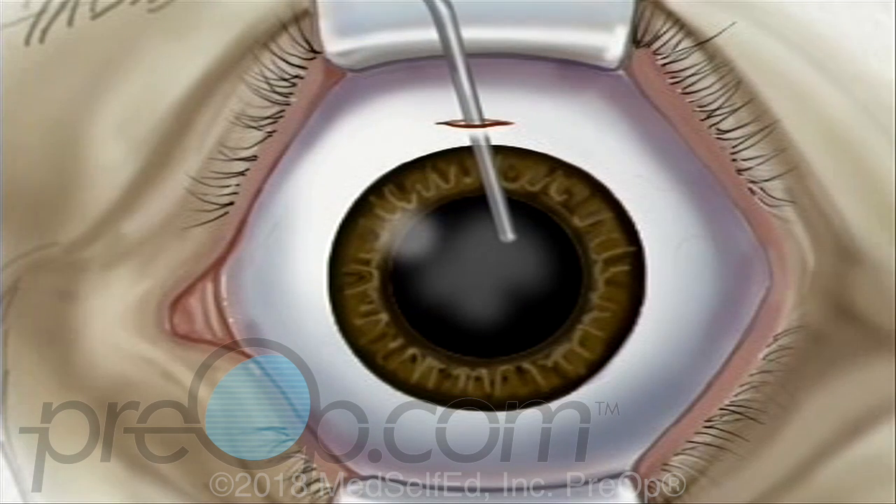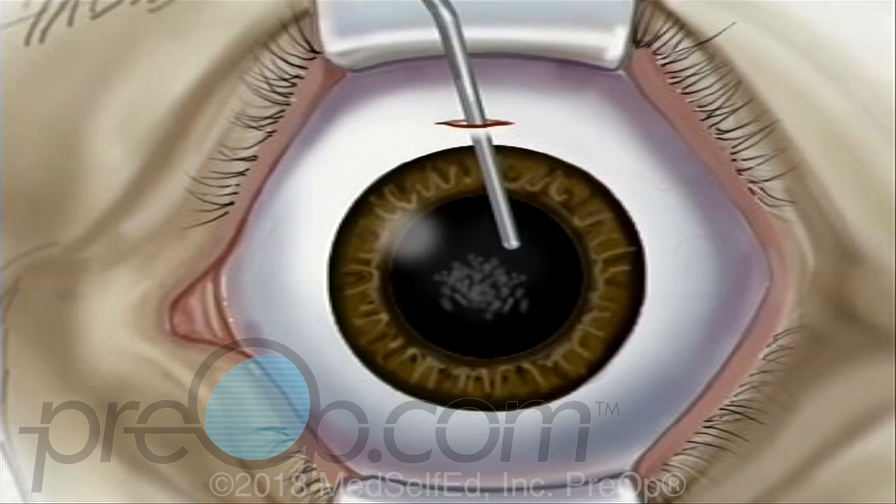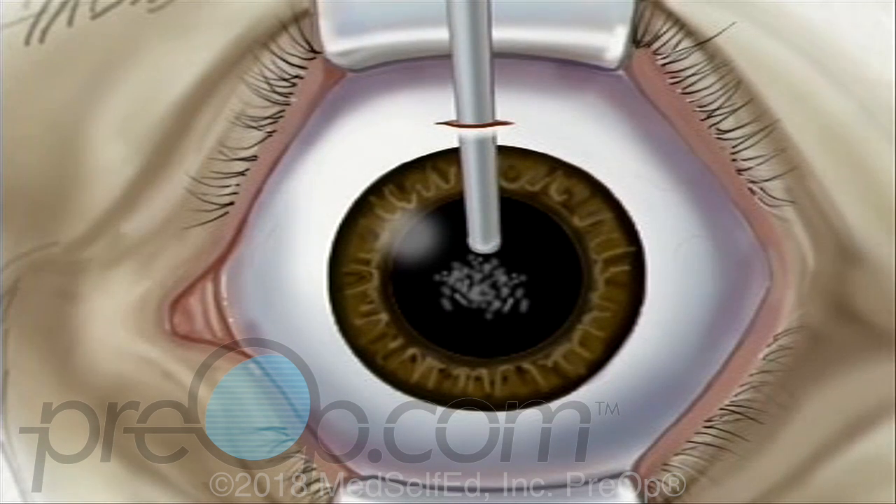Next, the surgeon will open the top of the capsule and remove the lens. Most likely, your doctor will use a small probe which vibrates at a high frequency. The probe vibrations break the old lens into microscopic pieces, which can then be drawn out with gentle suction.